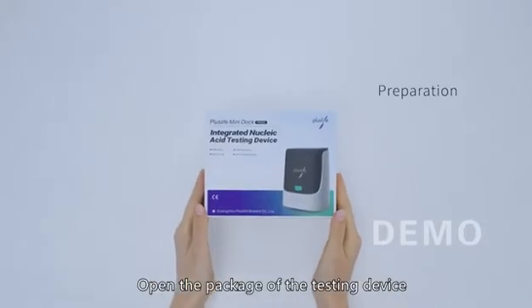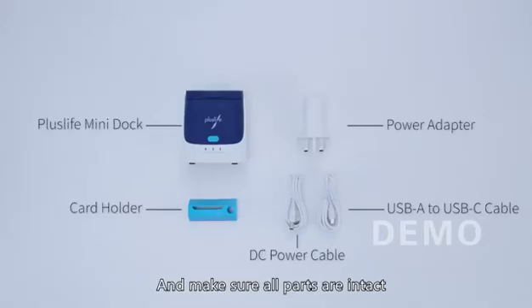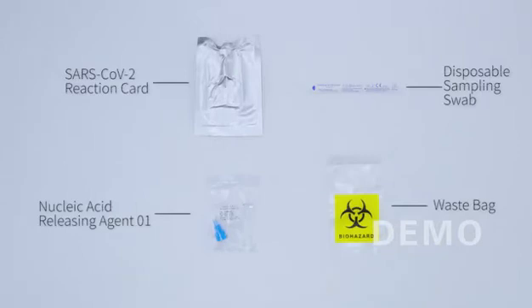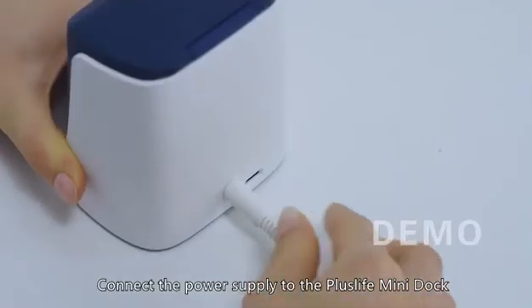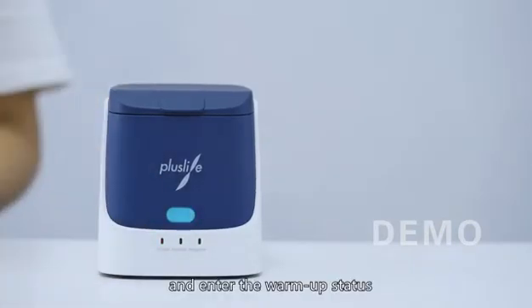Preparation: Open the package of the testing device and make sure all parts are intact. If vial leakage or package damage has occurred, this test kit should no longer be used. Connect the power supply to the PLUSLIFE mini dock, then press the button to enter warm-up status.